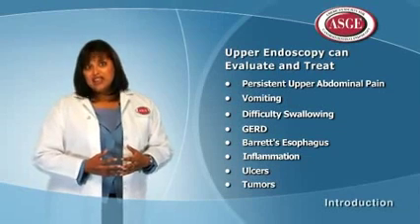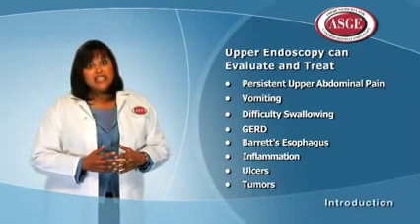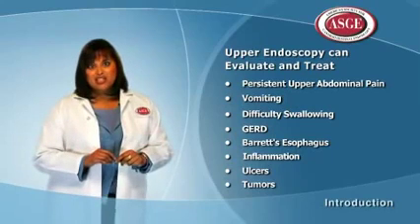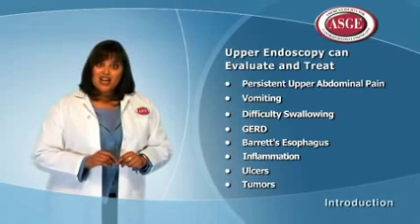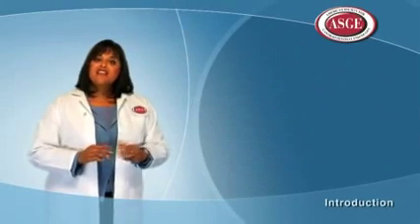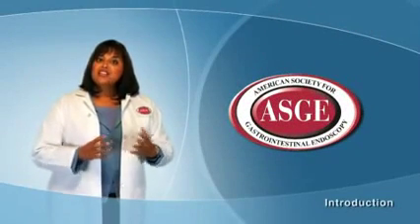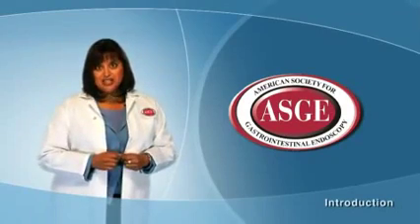Endoscopy is currently the best test for finding and treating many of the conditions that cause bleeding from the upper GI tract, and is also more accurate than X-rays for identifying inflammation, ulcers, and tumors of the esophagus, stomach, or duodenum. In the following video presented by the ASGE, you will learn what to expect before, during, and after an upper endoscopy.